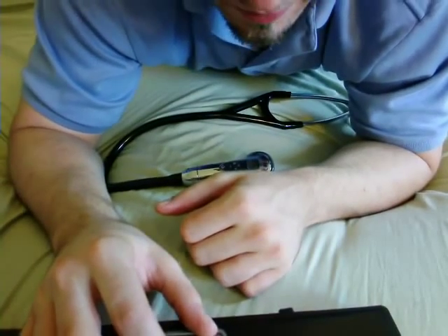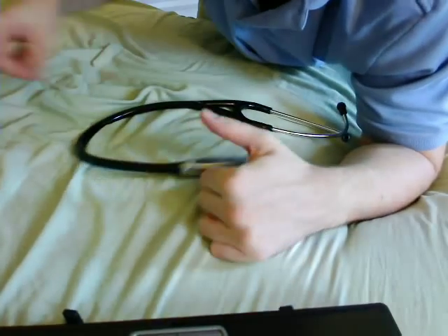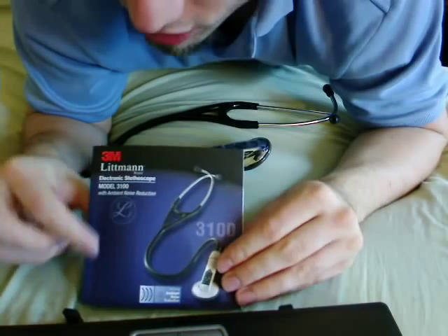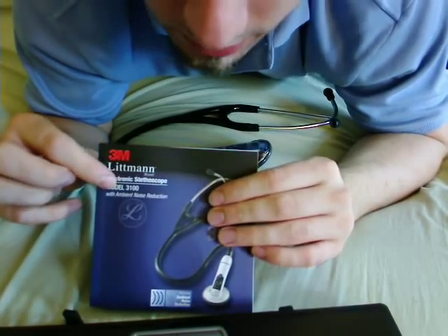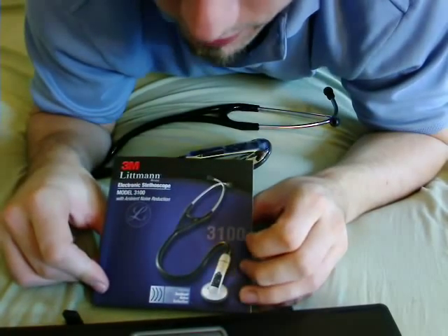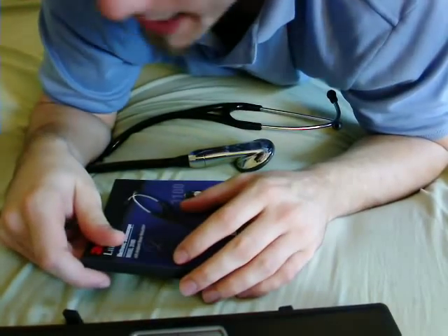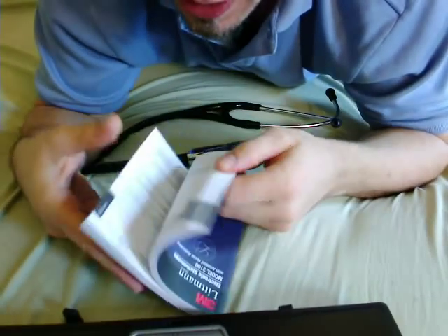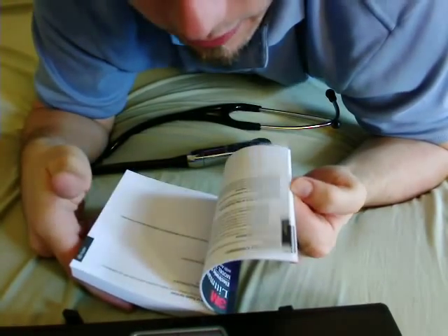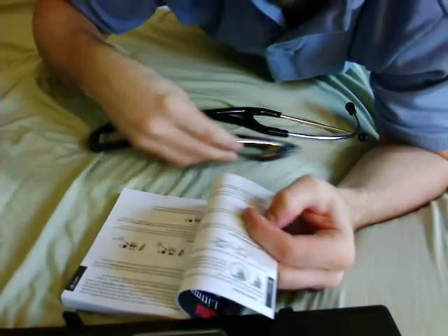This is video number two of my brand new Littmann 3M electronic stethoscope model 3100. The previous video I just made talks about everything — the packaging, the English section of the manual, including battery and anything you can think of in those pages. Before I go into this, let me talk about the final pages of the English section.